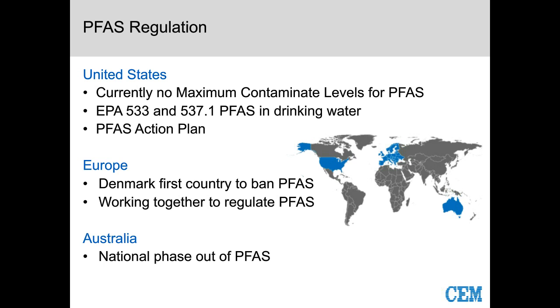And what you'll note in this talk is I'm going to focus on samples outside the drinking water sector to talk about some of those solid substances. I'm going to talk about soil and then get into food a little bit. And as we continue this PFAS work, we're going to see more and more sample matrices becoming of interest. But really at this stage, we have to adapt all the methods off of the EPA methods that we currently do have. The United States does have a PFAS action plan, so we're working cross-agency, being very diligent, so we are taking this very seriously. There's a lot of current work being done.